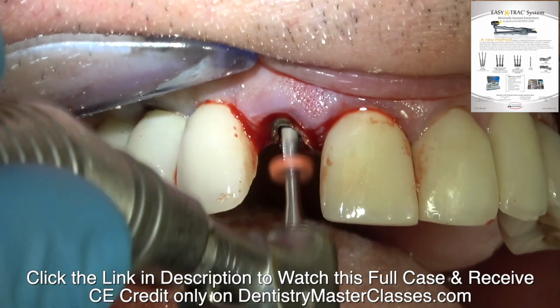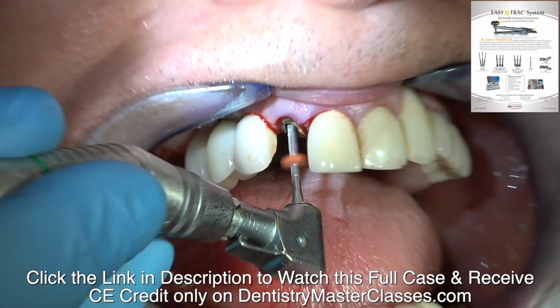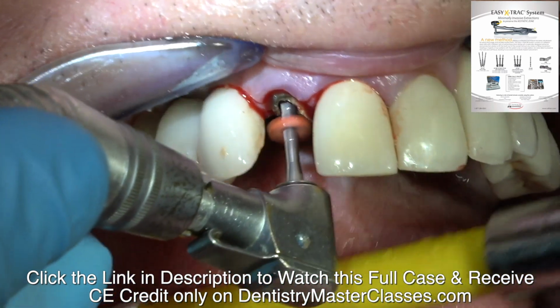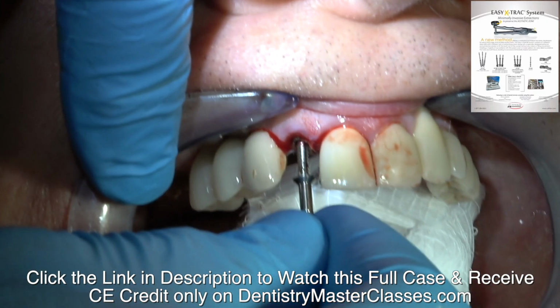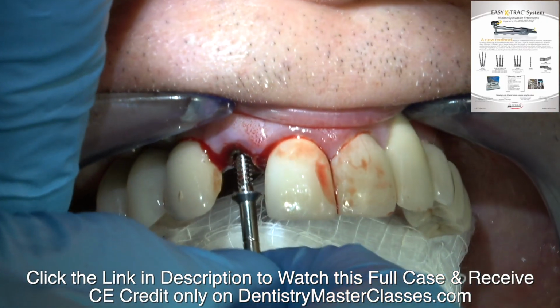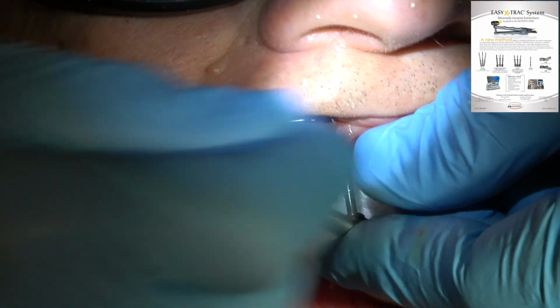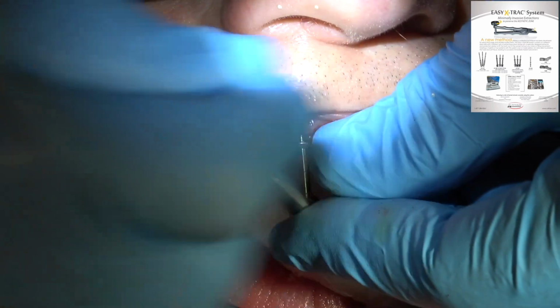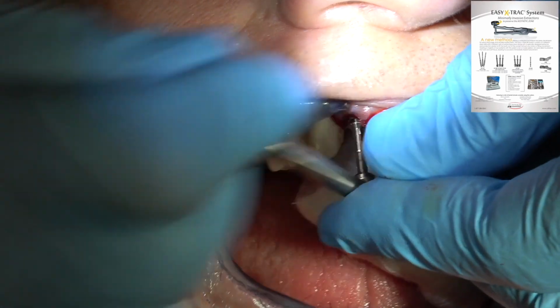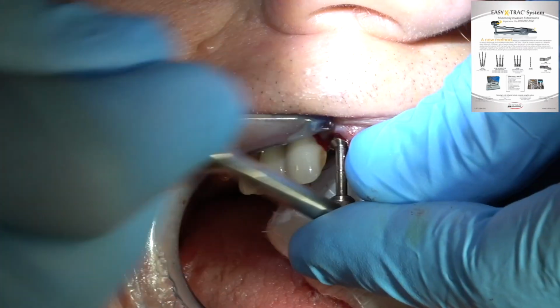Then there's 3 different widths, 3 different diameters, and each of them I drill to the same depth, all of them about 10. Then you've got different widths of these screws that you screw into the orifice that you've drilled into the tooth. So you want these to bind, so you have to use the ratchet wrench to screw it in. And you want to flatten the coronal part of the root so that this screw screws flat with the coronal part.